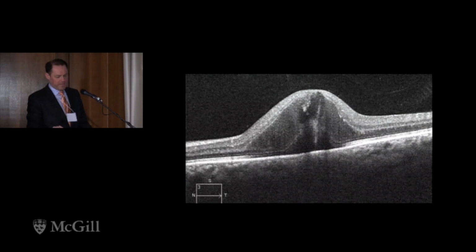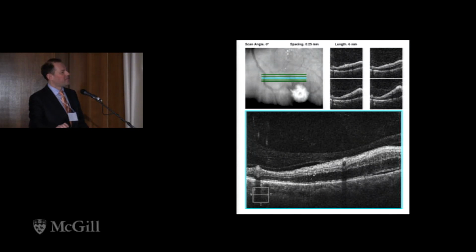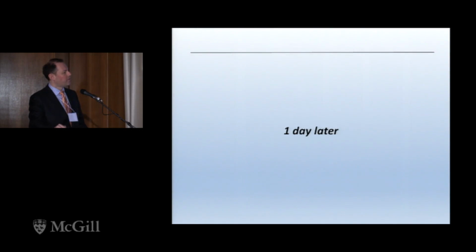And what they found was that this is an OCT in the fovea. So you remember before, the fovea wasn't really that significantly affected, but now it's affected. So there's a strong exudative response from treatment to this hemangioma. And as we go through the images, you'll see that there's quite a bit of edema in the retina.